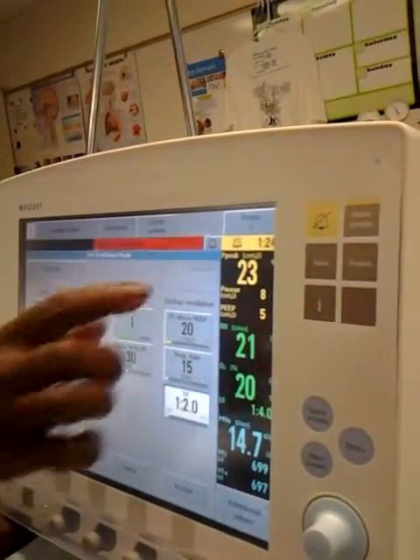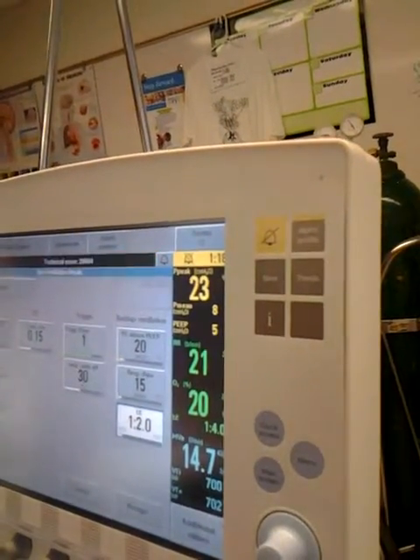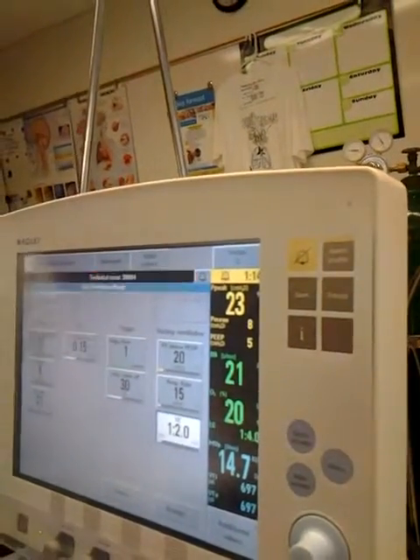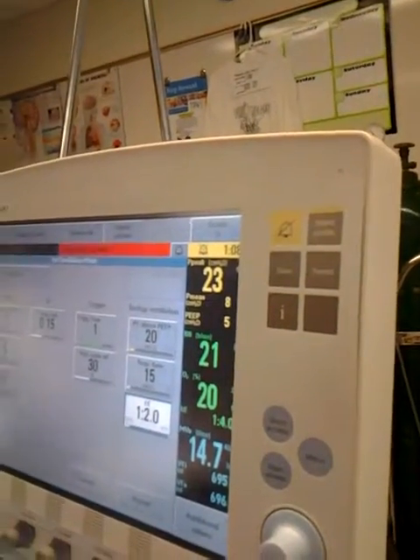All right? Okay. This is for your backup ventilation, Caitlin. It's not for the patient breathing spontaneously. When a patient is breathing spontaneously, you're not setting an I time. That's pressure support. Yeah, good, because when you're setting that, it's for the machine breath. When your patient's breathing spontaneously, you're not going to tell them how.